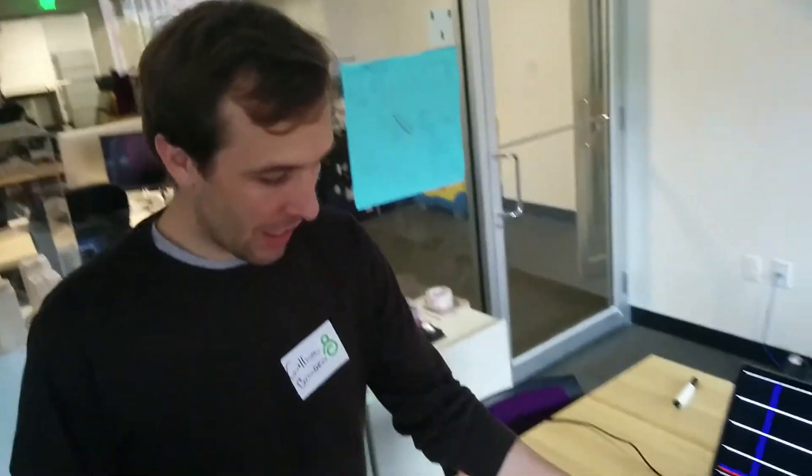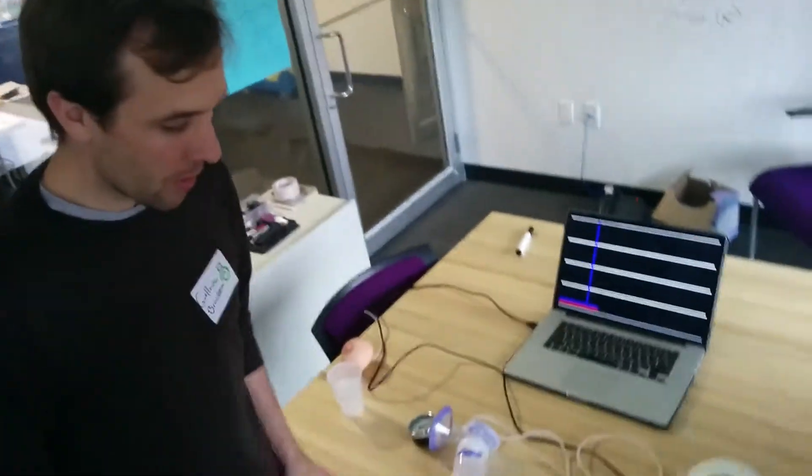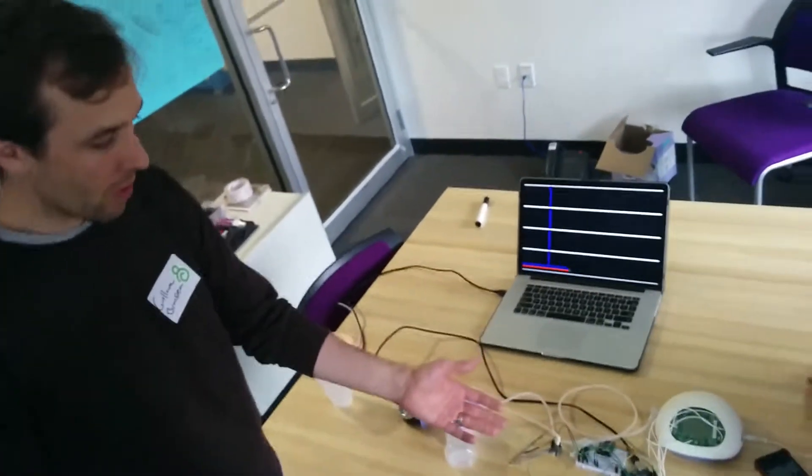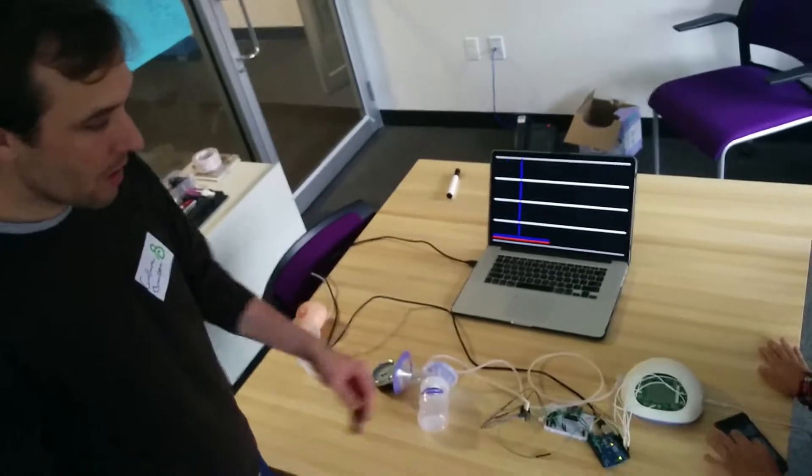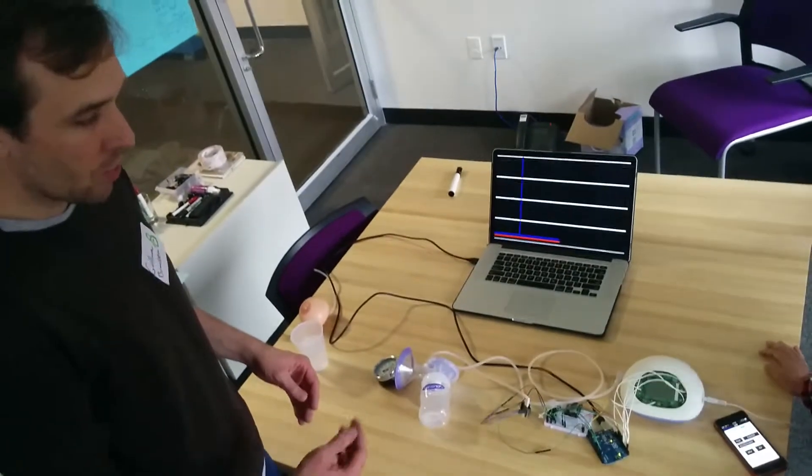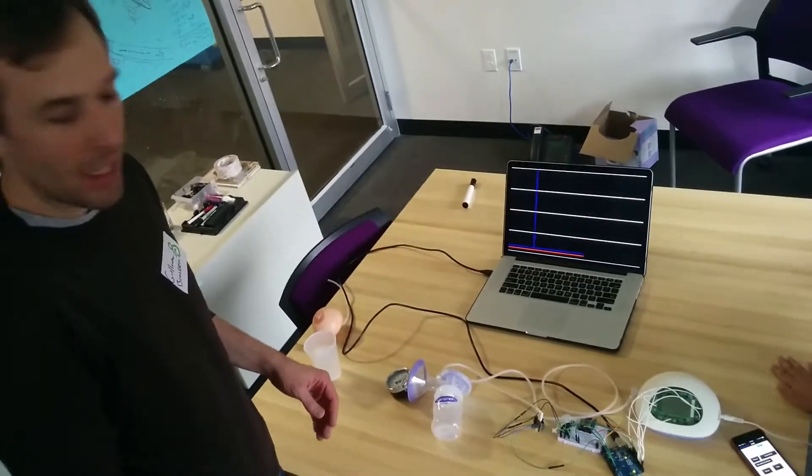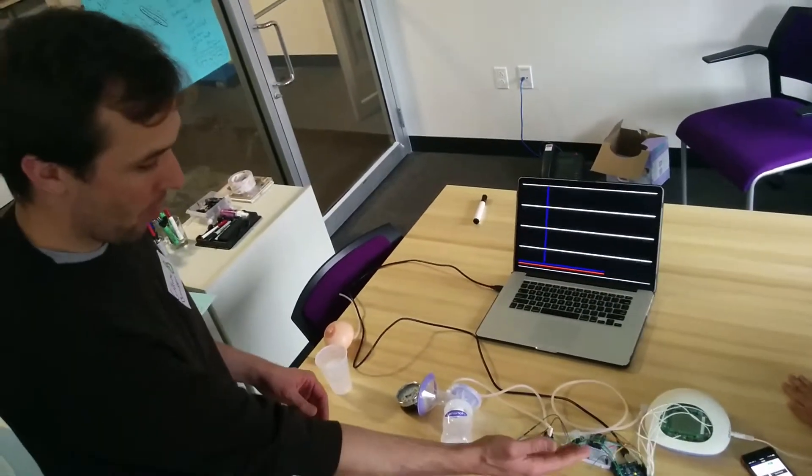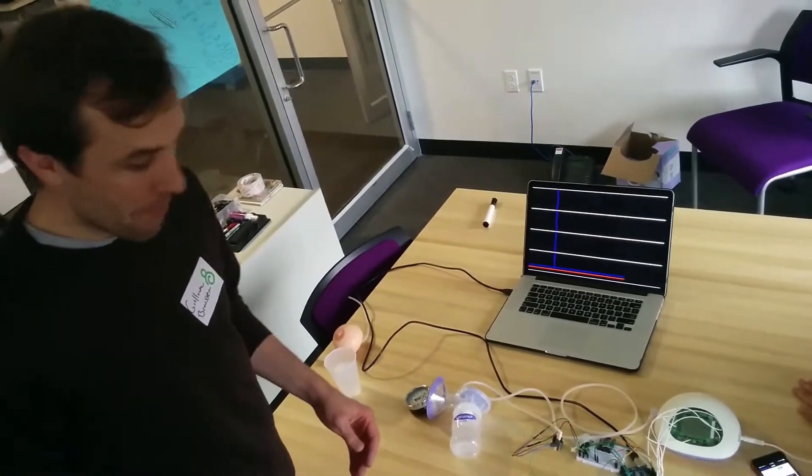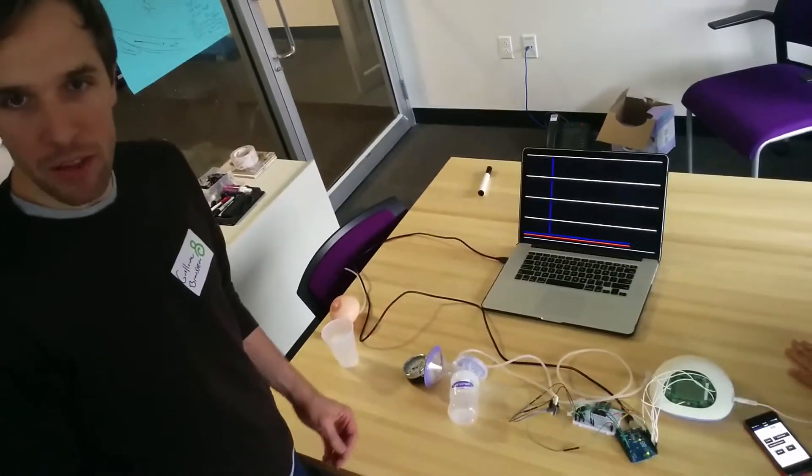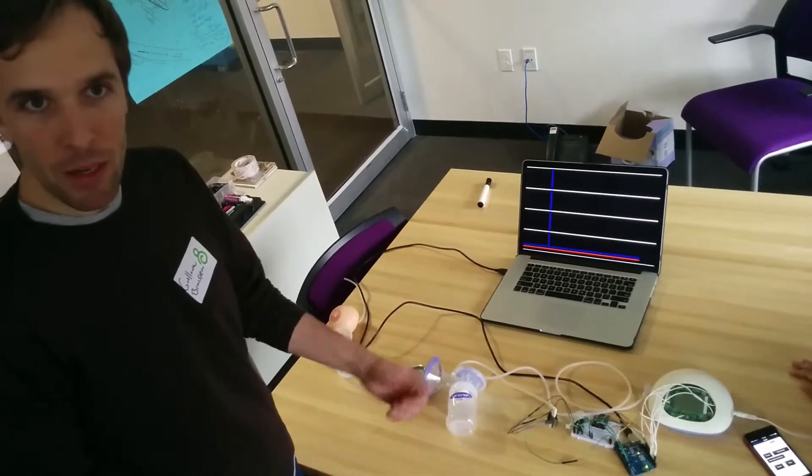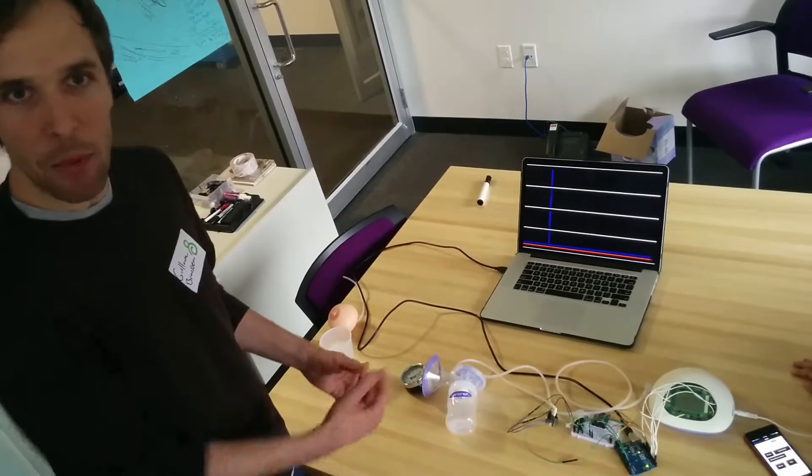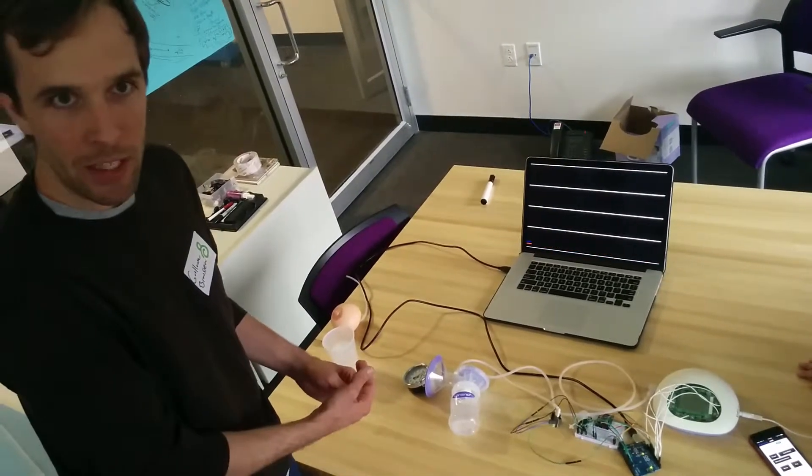What we have hooked up here is a breast pump hooked up to an Arduino controller. We're going to control it using a smartphone and be able to measure the pump output and the output at the user interface.